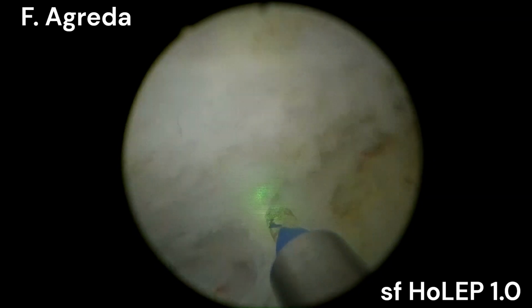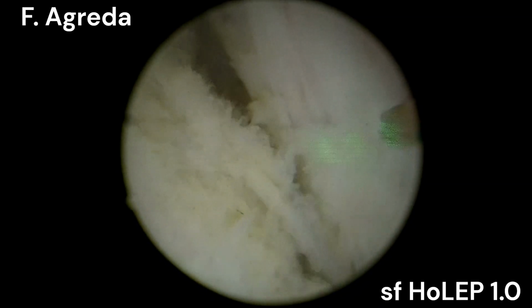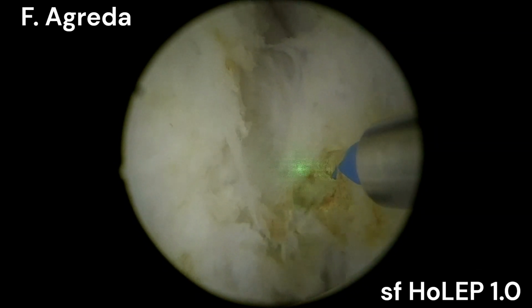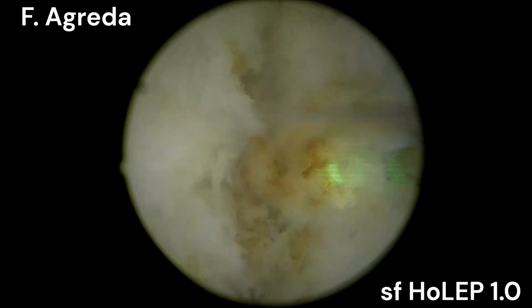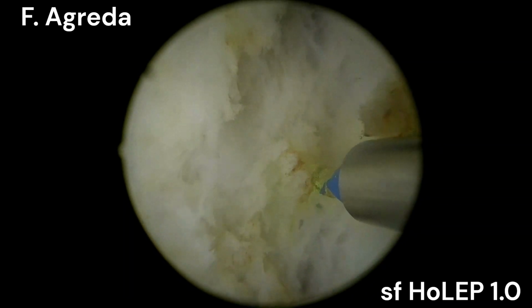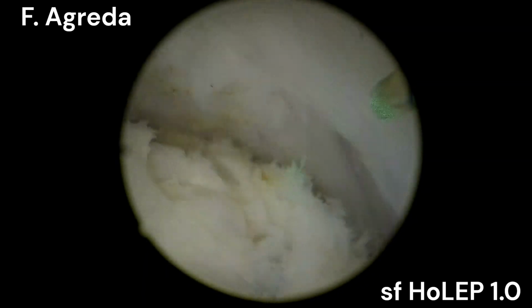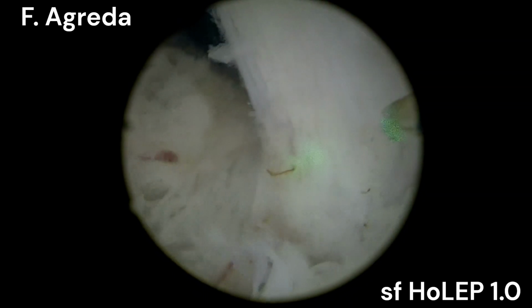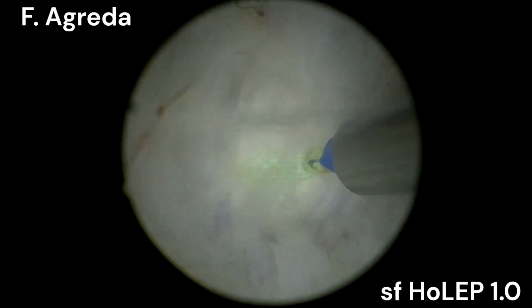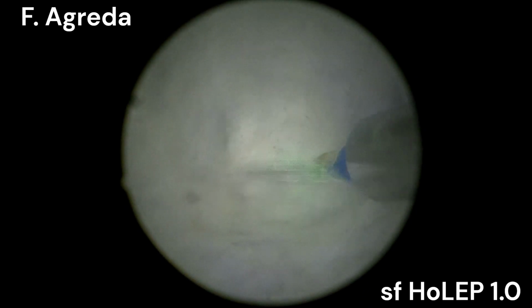Always keeping this distance of widening. My scope is doing the setting the two structures, capsule and adenoma, in tension, not blunt dissection, and the laser is cutting through and vaporizing, or as you can see white and bubbles in the tissue that is being cut or dissected, I would say, more than cut, by this HoLEP laser.